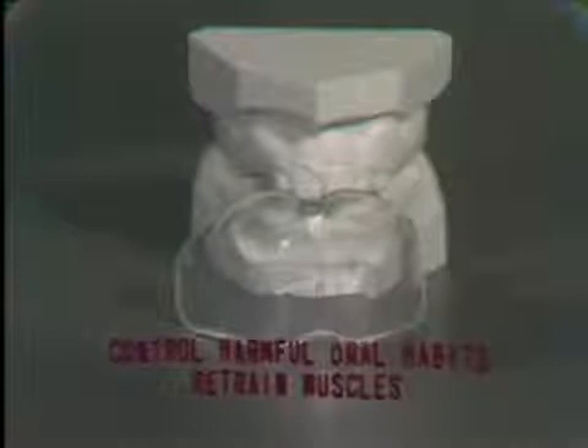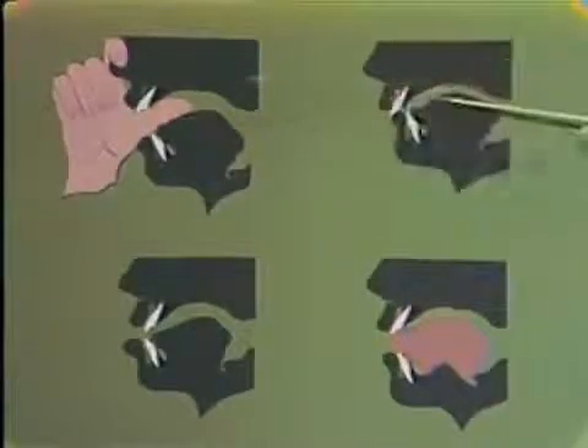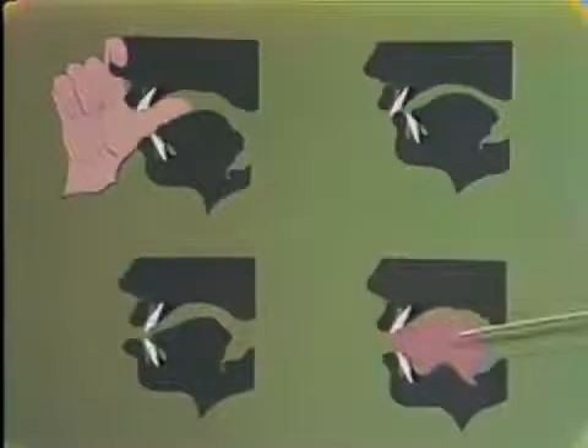This appliance has as its primary clinical use the control of harmful oral habits. Thus, the muscles in the perioral region that are abnormally functioning may be retrained. This appliance can be used as an aid in treating thumb and finger-sucking habits, lip-biting habits, mouth-breathing or open-lip posture, and also, to some extent, in the treatment of tongue-thrust problems.